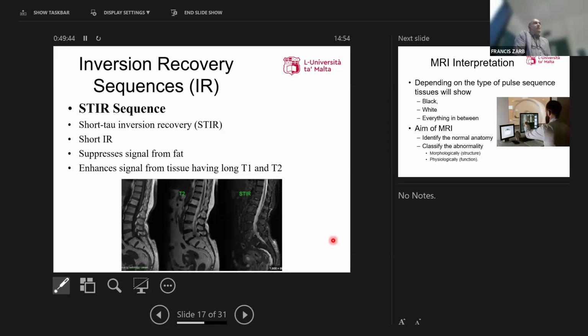Ħafna drabi STIR jagħmlu għax għandek effect iktar, you cannot exclude li tuża FLAIR jew STIR. Rari tuża STIR fil-brain, għax ma tantx se jkollok fatty changes in the brain. It's more fluid changes. Ma any other parts in the body, you can use either depending on.